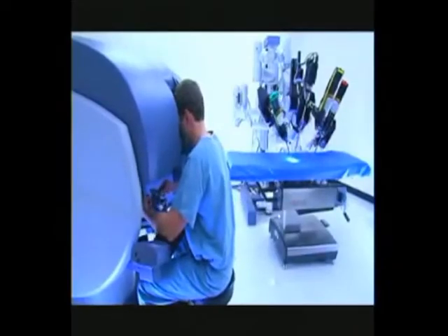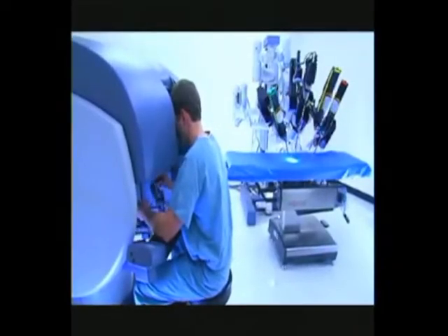Yes. Let me tell you a bit about that. This is a revolutionary concept. The surgeon is not next to the patient. He's nowhere near the table. He's sitting on a console somewhere far away, but in the room, of course. In the same room. So that's because of the communication. He can jolly well be in the next room and still work.